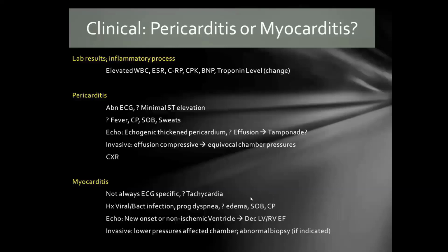And a lot of times you'll be called to do an echo for this exact reason, to see if there's an effusion, to see if an effusion is larger to fit how this patient is starting to deteriorate. And of course, they may or may not have invasive lines. I know there's a lot of admissions with these patients, and again, it's going to vary based on the center that they're admitted to.